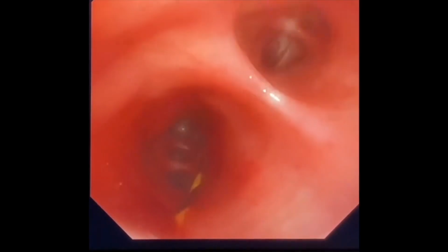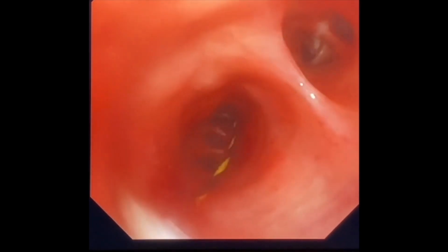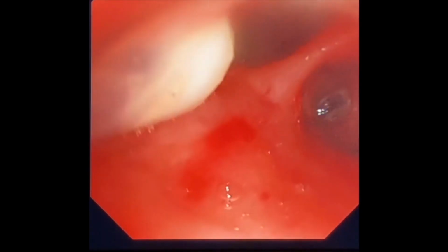So the bronchoscopist now is following the stent to the distal left main bronchus, aiming to open the stent just as the left upper lobe and left lower lobe divide. And that's the left upper lobe and left lower lobe divisions just there.